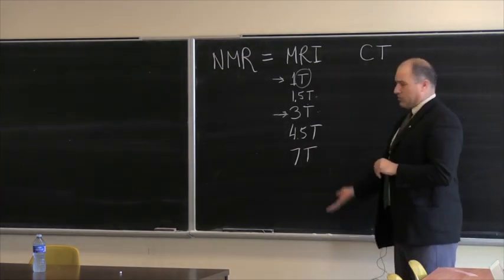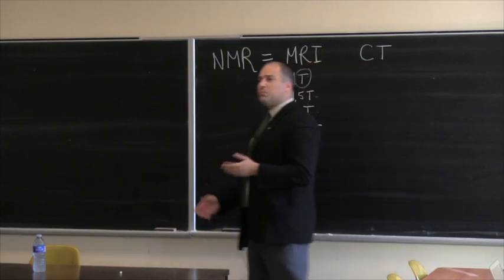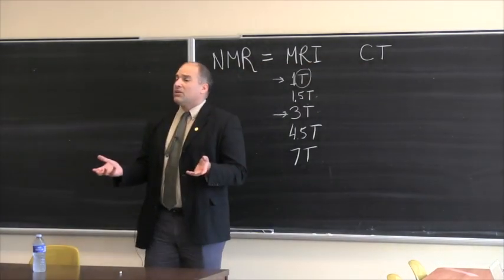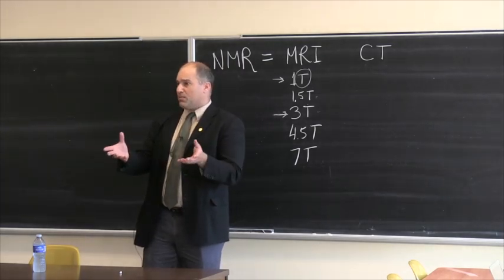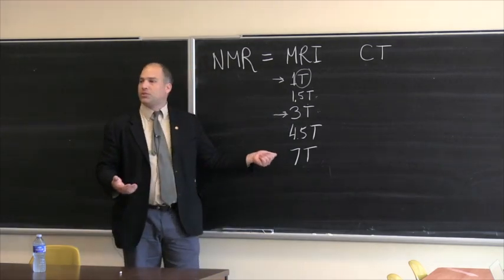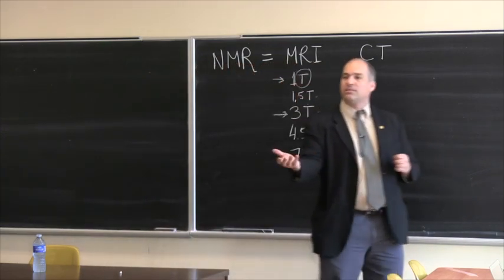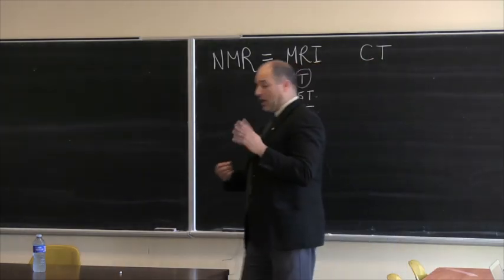What is the advantage of pushing the field higher? What do you think? Why would people push the field higher and higher? So, when you buy a car, you want lots of horsepower, right? Because for the same stable, you get more horses. So why not? But what does it give you to push the magnetic field? Why are people so fascinated with that, do you think? Better resolution. That's exactly the right answer, better resolution.